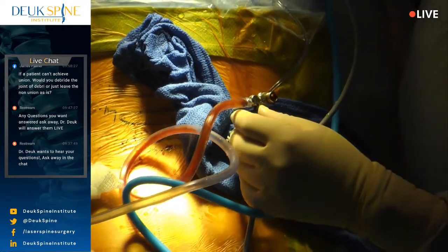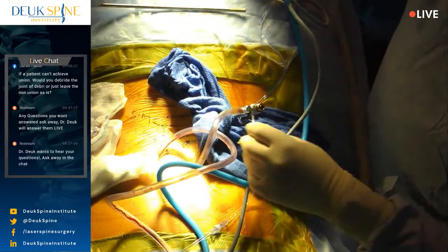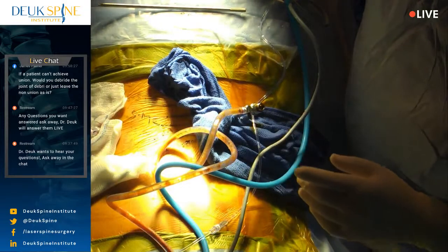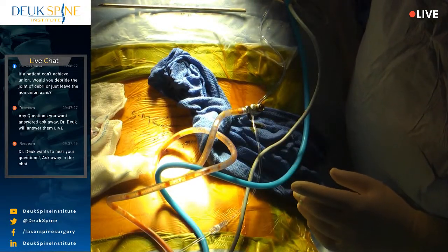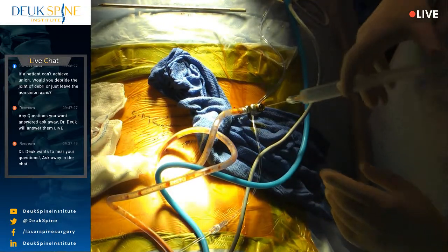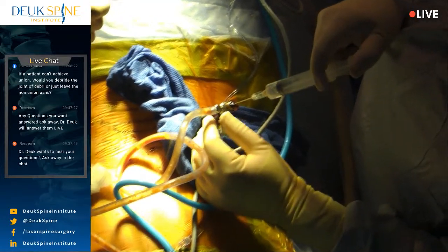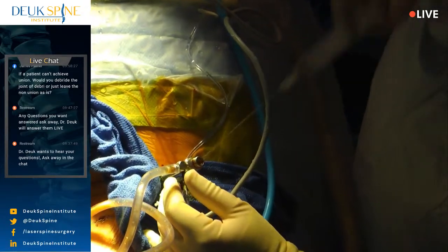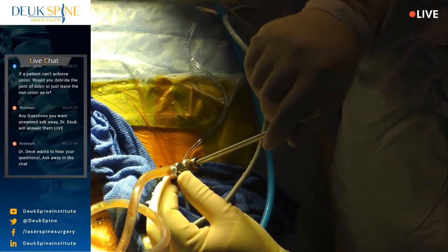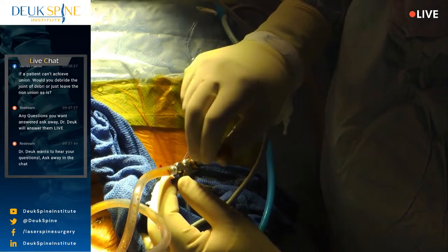So we're going to irrigate with, sorry, not antibiotic, but I guess it is antibiotic, antiseptic. We call it benzoin, not benzoin, I apologize, betadine. It's developed by NASA, which is very close to where we are, literally 10, 15 minutes away. Depends on how fast you drive. But we used to watch the space shuttle launches here from our building.